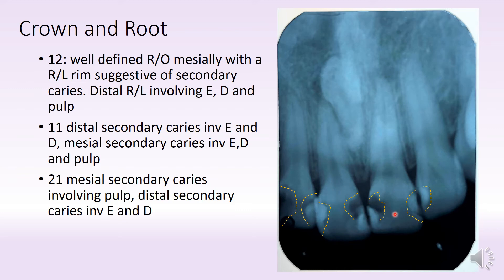Then moving on to 2-1, you also see that there is a large secondary caries — a radiolucency surrounding the radiopacity on the mesial surface — which is again indicative of secondary caries involving the pulp of the tooth.